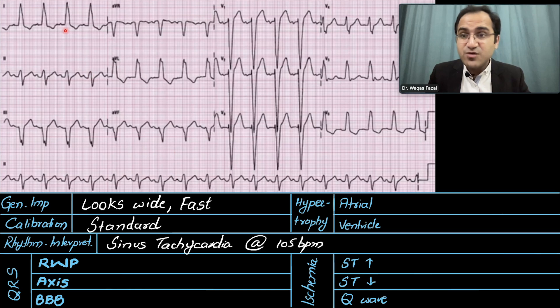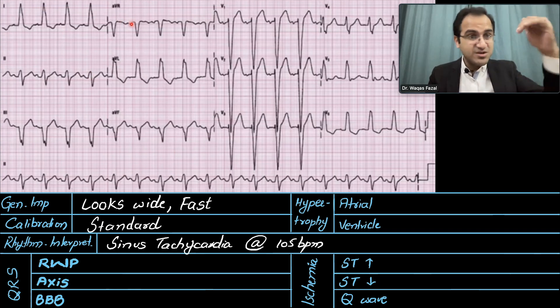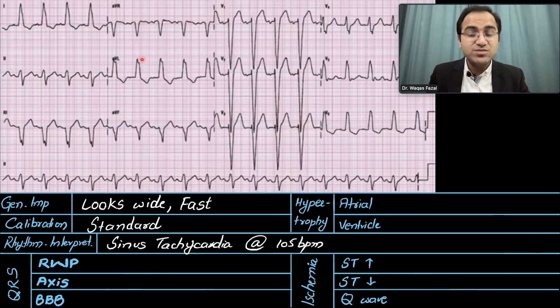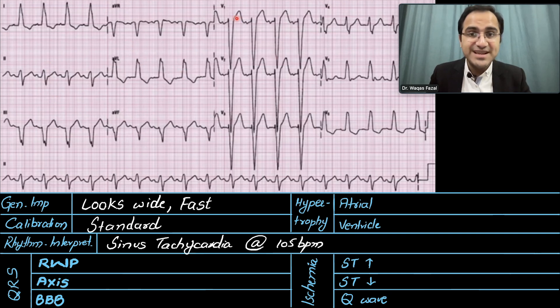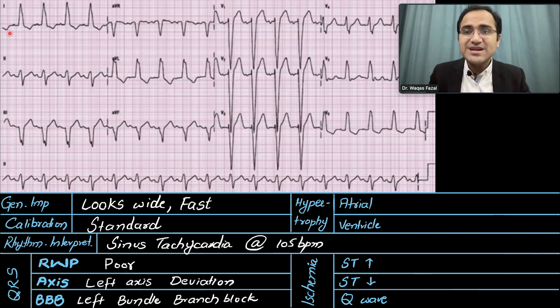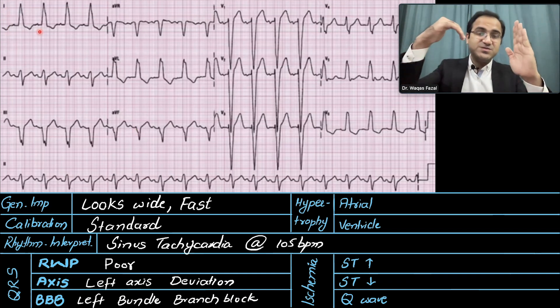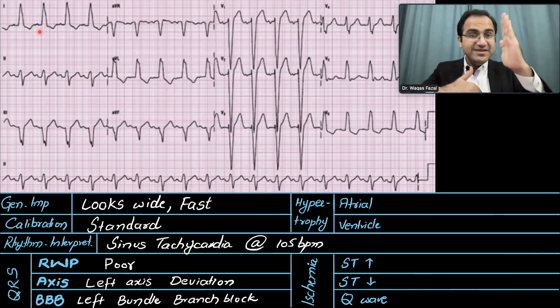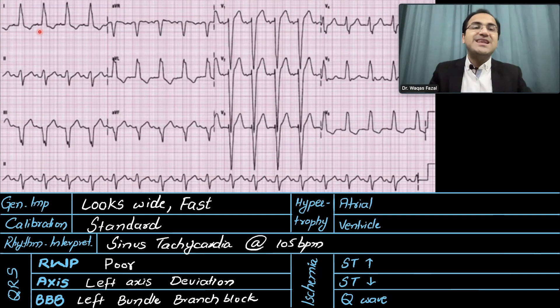Looking at R wave progression: in the hexaxial leads AVR should be negatively deflected; in all other hexaxial leads it should be positive. It is negatively deflected in AVF, which is not normal — so it is poor R wave progression. In precordial leads V1/V2 are negative and V5/V6 are positive, which is normal. For the axis, lead 1 is pointing upward and AVF is pointing downward — they are pointing away from each other, so that is a left axis deviation.